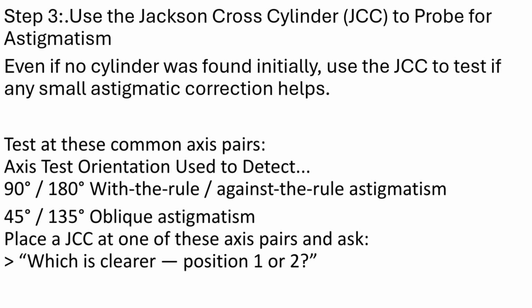And I will give you a small tip. Hyperopic patients may mask small cylinder due to accommodation, and always double check monocular visual acuity because sometimes astigmatism is relieved only in one eye.